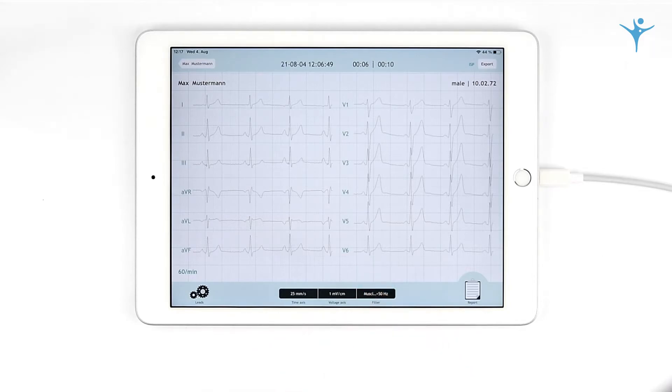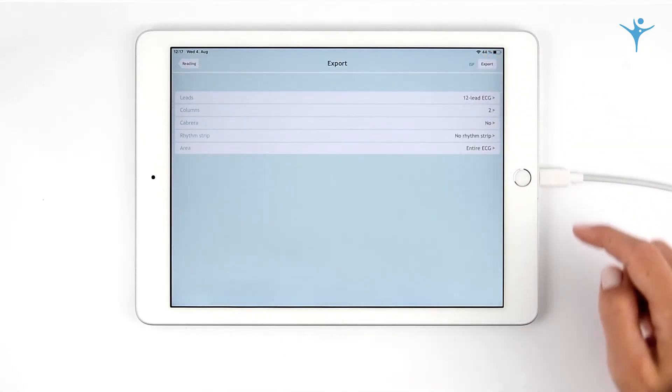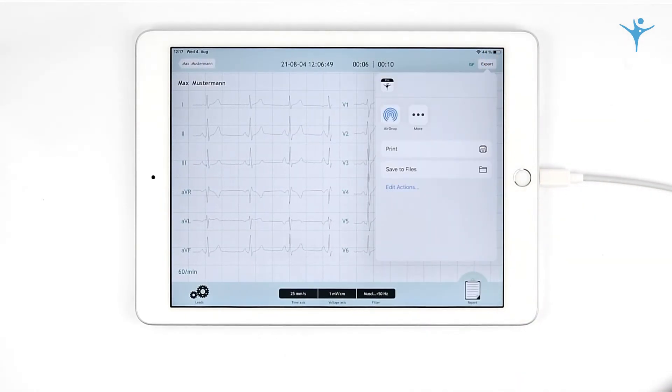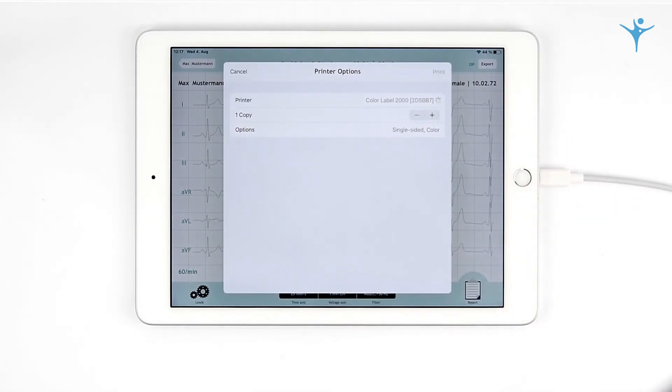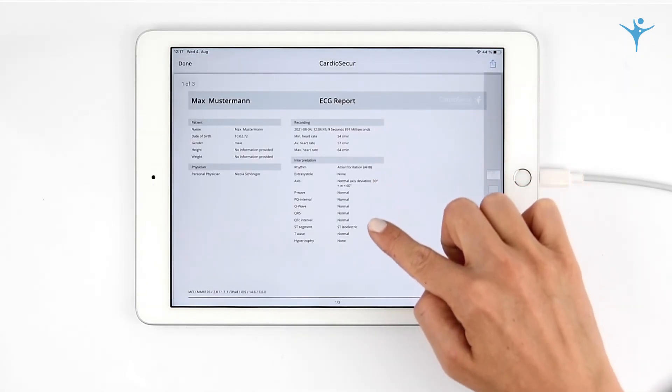Before exporting, CardiSecure offers you several display preferences for your PDF report. Readings can be exported easily and safely via AirDrop, AirPrint, and Email Intranet. Should you require any support, we will be happy to help you.